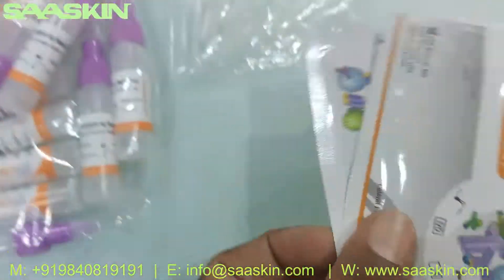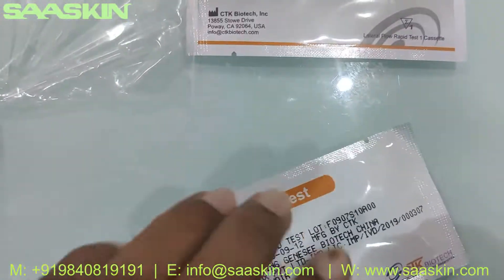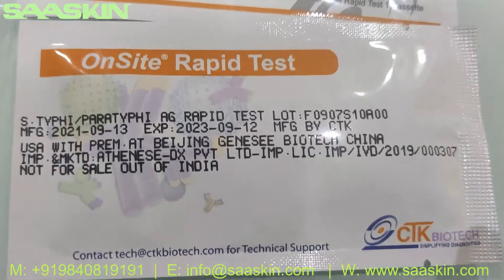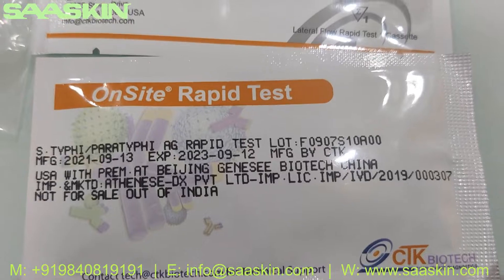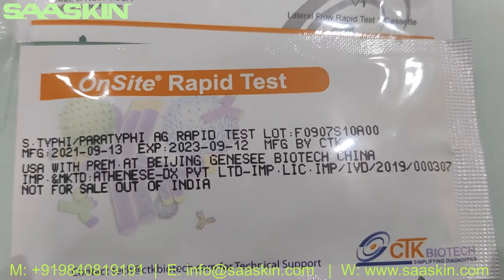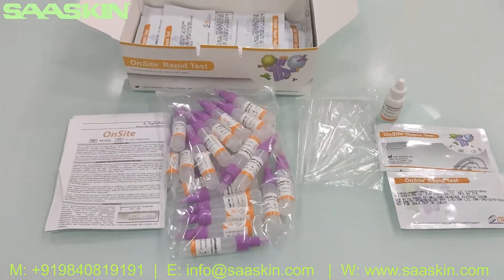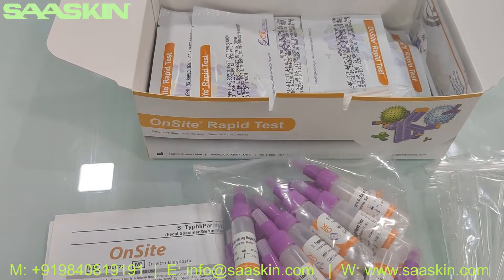Let me go inside the test cassettes. Let me open the cassette and keep some cassettes here. You can see it's the OnSite rapid test for S-typhi/Paratyphi antigen. You have to check the expiry period for these kits. So quickly to summarize, this is from CTK Biotech USA — 25-test kit pack of OnSite rapid test.